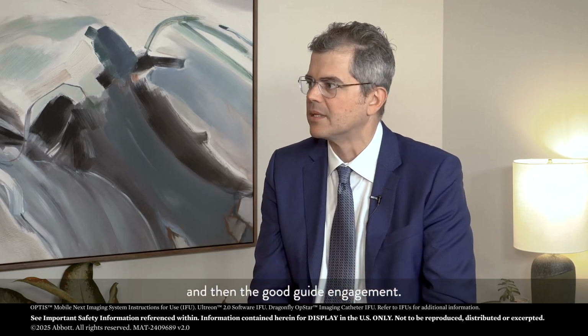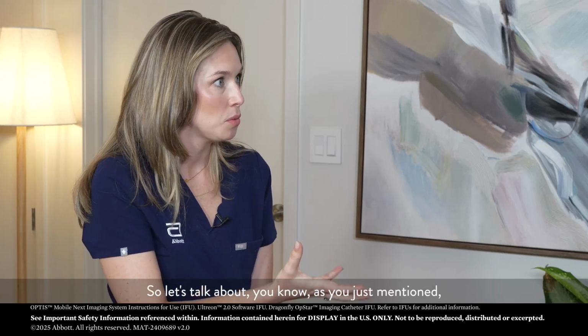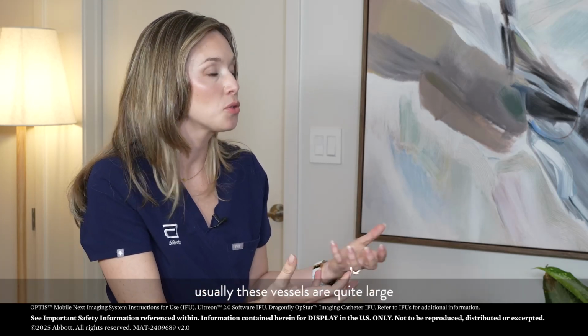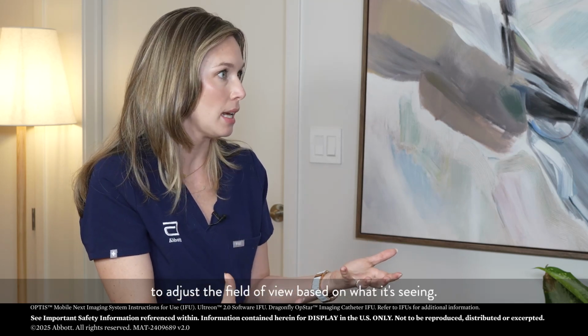So let's talk about, as you just mentioned, usually these vessels are quite large. And on the OCT software in Ultreon 2.0, the software does work to adjust the field of view based on what it's seeing.